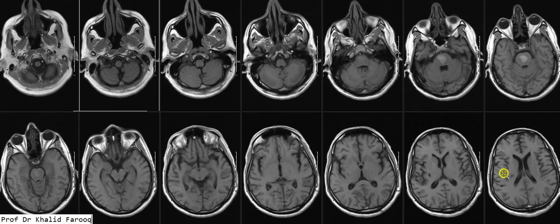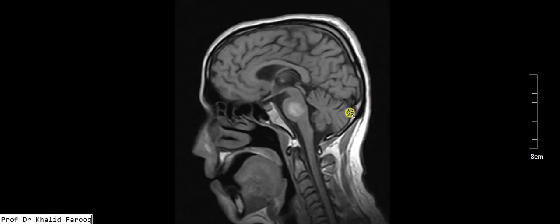In the right periventricular region extending down with involvement of the posterior portion of the right basal ganglia, suggesting old ischemic changes in this region. This can be confirmed on the sagittal T1-weighted sequence, where we can see hemorrhage in the pons.